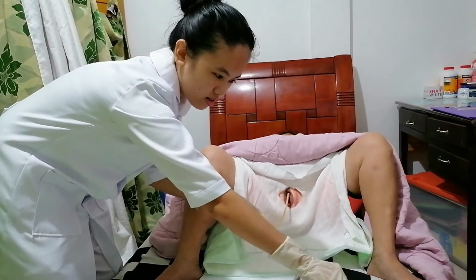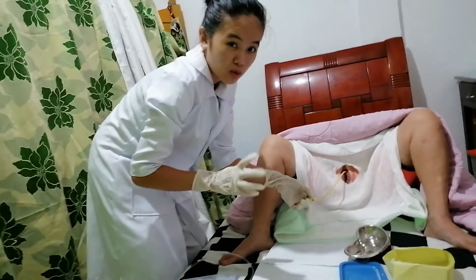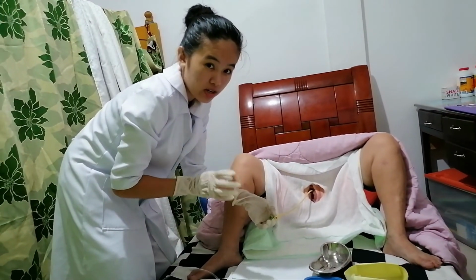And then discard this one. After that, I'm going to connect the urinary bag.